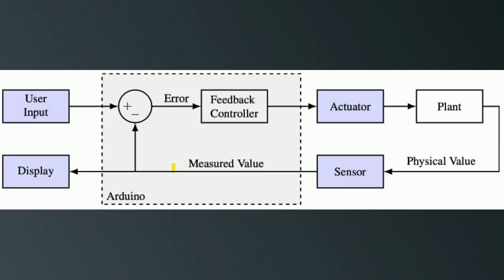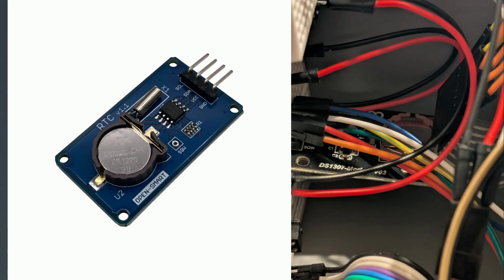Our projects required four specific styles of component. These requirements were a user input component, a sensor component, a display component, and an actuator component. For my sensor component, I chose a real-time clock which measures time. It is uploaded a time from the device that uploads the code to it, and with that it can then compare values and run functions that allow it to pull values from itself.